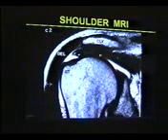There is a shoulder. You can see the deltoid, some fluid, the subacromial subdeltoid bursa, this is the clavicle. Shoulder at MRI, and when you compare this area with ultrasound, you can see the same fluid in the subacromial subdeltoid bursa. This is the deltoid muscle, greater tuberosity and fluid, and you can confirm it on the other axis.